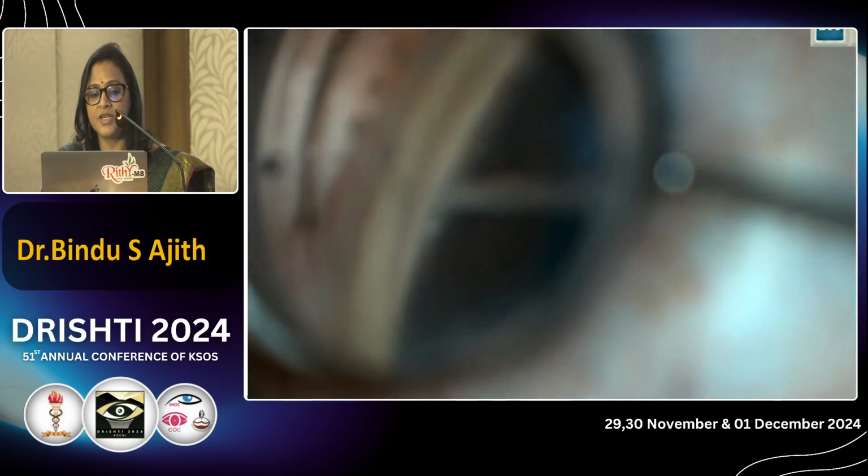So that is the difficulty you have. You can't properly focus and you can't properly operate if you have a steep angle view.